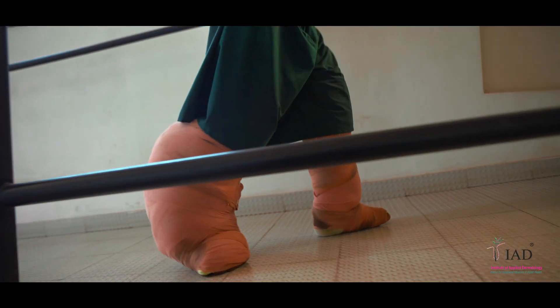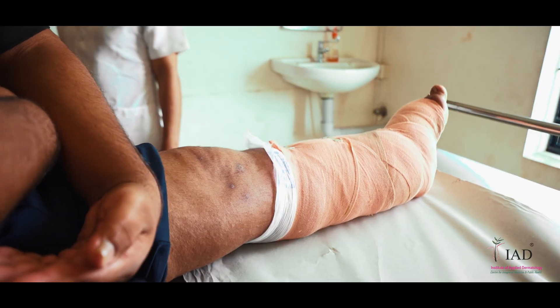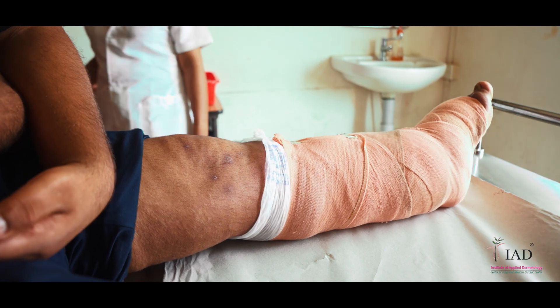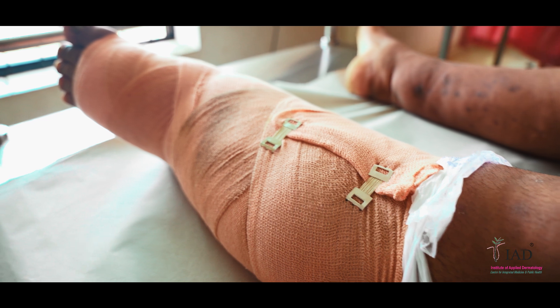This completes the compression therapy process. However, we strongly advise you to understand the following tips which would help the whole therapy process.